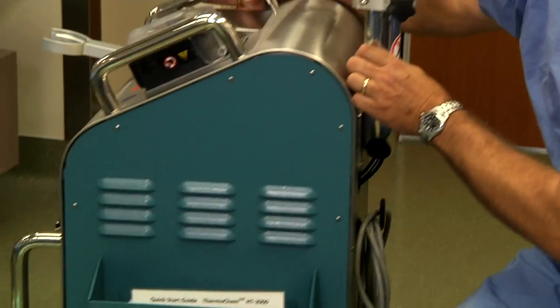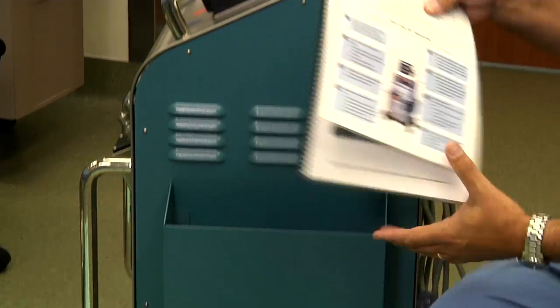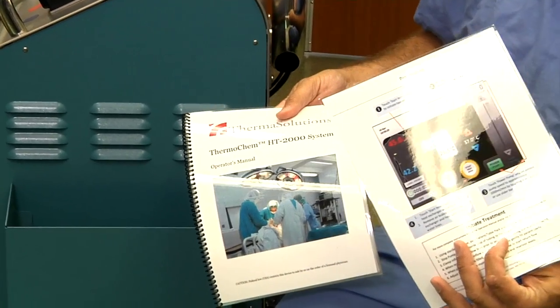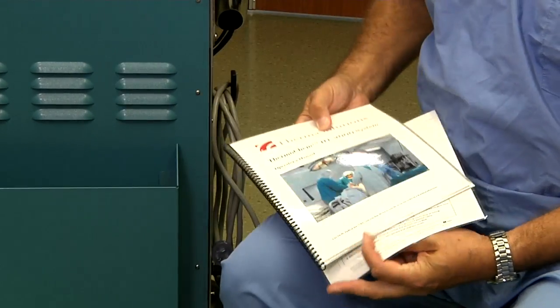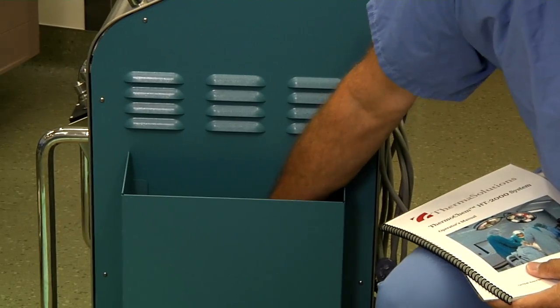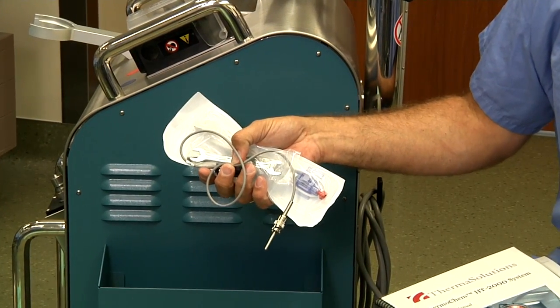On the opposite side of the device we have the side pocket, which contains both the quick start manual as well as the user guide. In addition, there will be backup components that are held in the pocket.